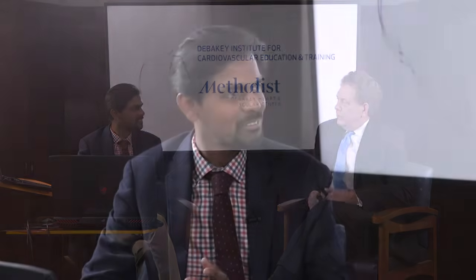Sure. Thank you very much for this wonderful opportunity. I'm very grateful to be here sitting in this first edition of CV Live and sharing what I have learned by spending 8+ years in the operating room, learning how we can make these surgical procedures really better by utilizing all these imaging technologies. So the concept we are trying to address here is a great example of how, being in the field and working very closely with the surgeons, we were able to address the diagnostic pathway and imaging for these patients.